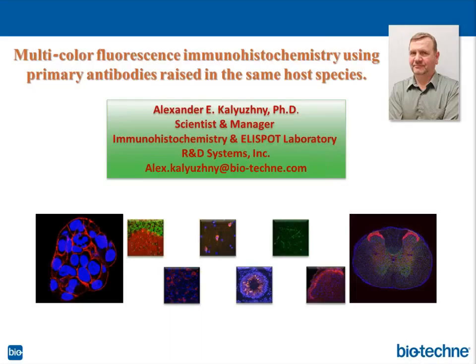Another technique people use, which you may Google and find, is to incubate tissue sections with copper sulfate. Freshly made copper sulfate, I believe in citrate buffer. Also do a Google search and you will find a recipe for how to do this. So these are the 2 techniques I can think of.